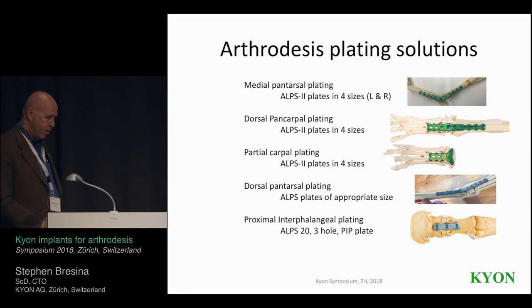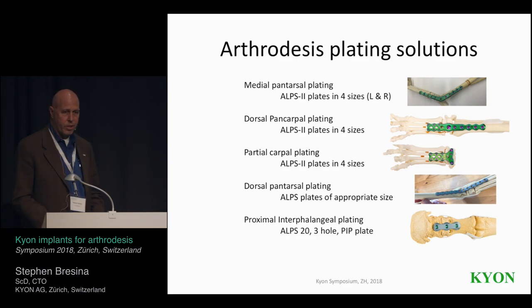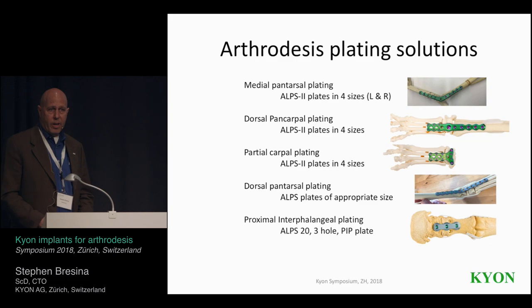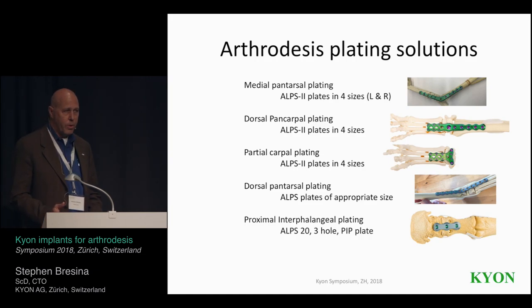So Alessandro and I spent some time on cadavers and came up with plans. Those two plates, the pancarpal and partial carpal, are done together with Dr. Peters. Then we looked at using an ALPS for a pantarsal plating system. Some of our more experienced ALPS users have done ALPS for just pancarpal, but not for pantarsal, because they feel that the plate alone in this dorsal application would be too weak. So we'll show that in the AO course in Dubrovnik in collaboration with a medial pantarsal plate.